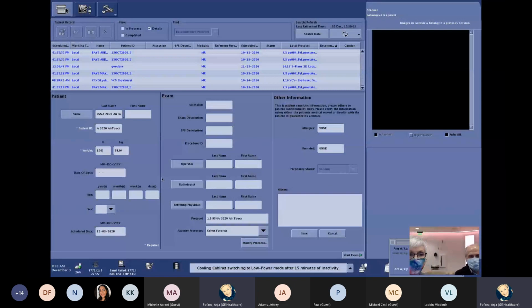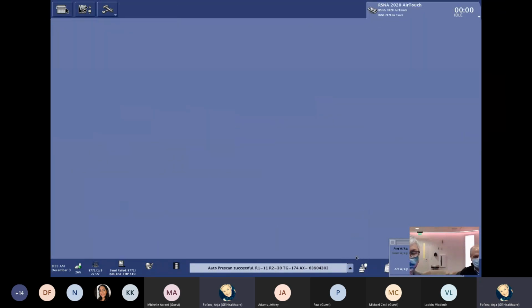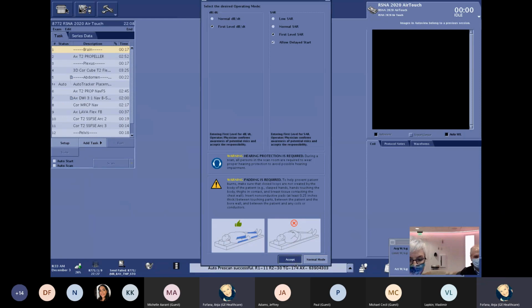So now we are back here at the user interface in our scan operator room. I already typed in all the information for the patient. I launched the protocol, and then I'm going to start the scanning session.